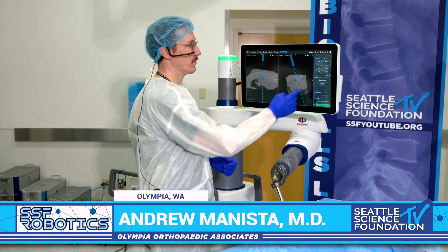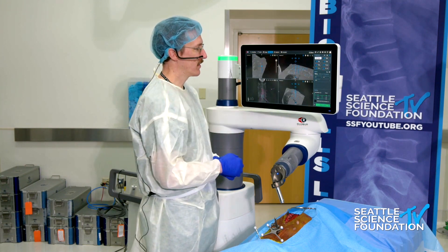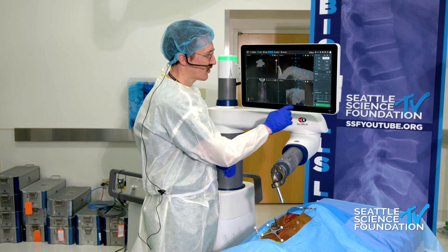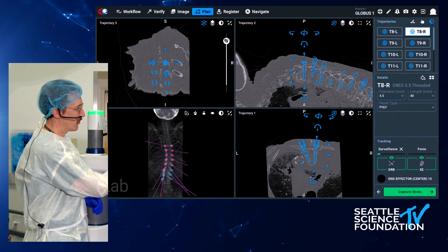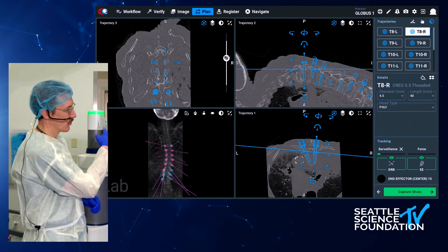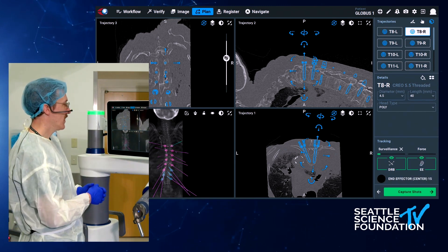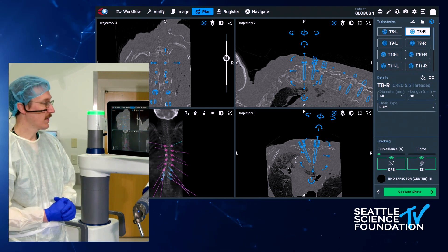First, I want to show you just how we program the robot. We've had our screws already mapped out here for most of the levels, but I left one off here at T8, and so we can just drag and drop that screw there, and then move it into the position that we want. We're going to try to maximize the minimal pedicle, and we can use this to see if we are contained as we go up and down the pedicle itself. The goal, of course, is to have it safely placed within the confines of the pedicle and have optimal trajectory so that we have the highest pull-out strength that we can achieve.